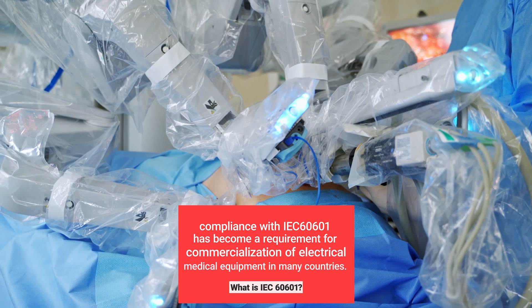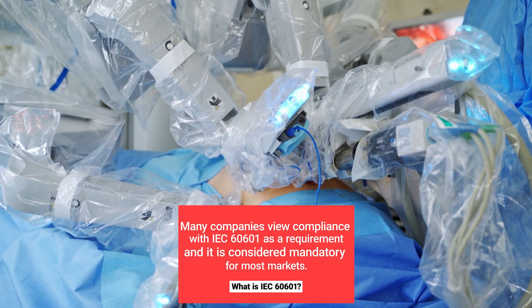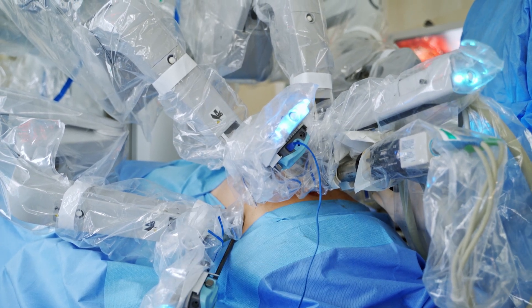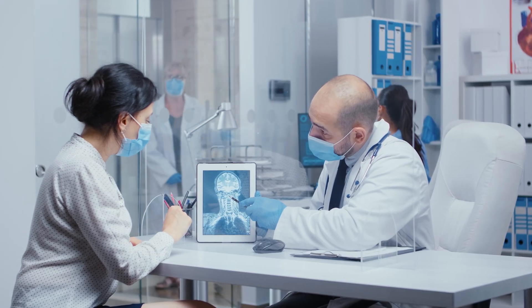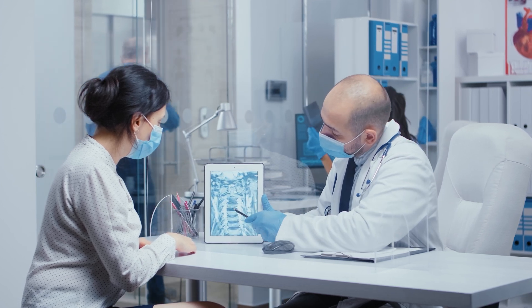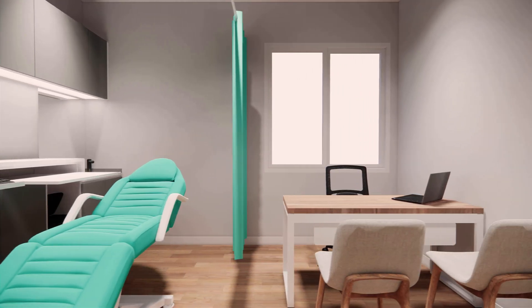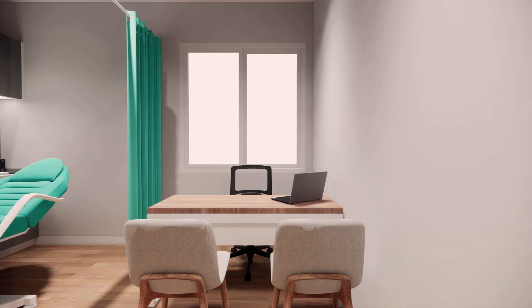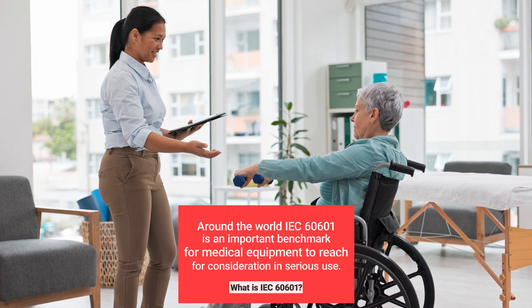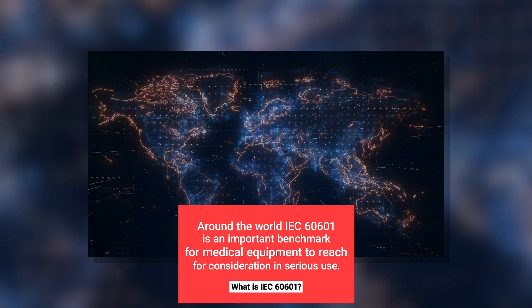IEC60601 is a series of technical standards for the safety and essential performance of medical electrical equipment, published by the International Electro-Technical Commission. 60601 is a widely accepted benchmark for medical electrical equipment, and compliance with IEC60601 has become a requirement for the commercialization of electrical medical equipment in many countries, including the EU, the US, and Canada, to show evidence of safety and performance.